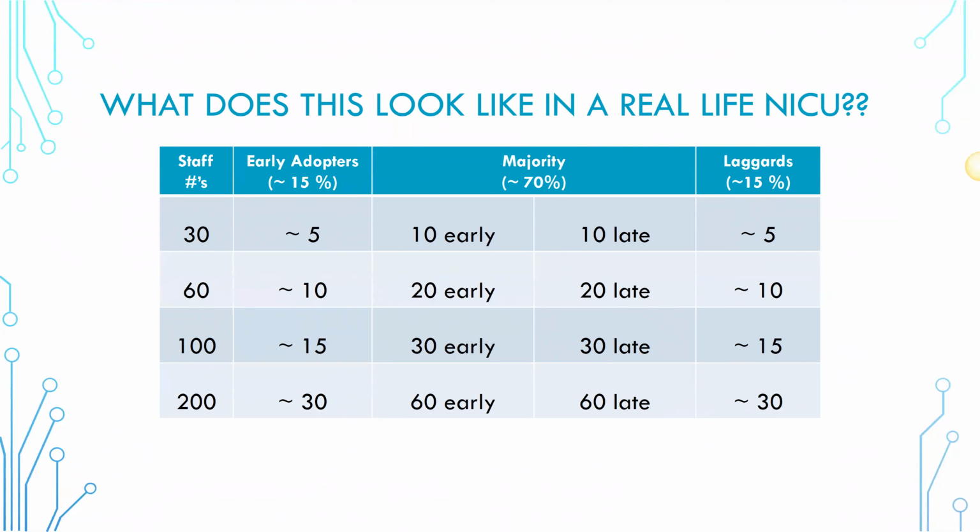So who will you notify? If you're the bedside nurse and you're taking care of a baby and you notice that there's increasing impedance, do you have a team leader or a super user who will come and fix that for you? Do you need to know how to do that yourself? Is that part of your skill set that's assigned to you? And then the other piece of notification is really changes from baseline.